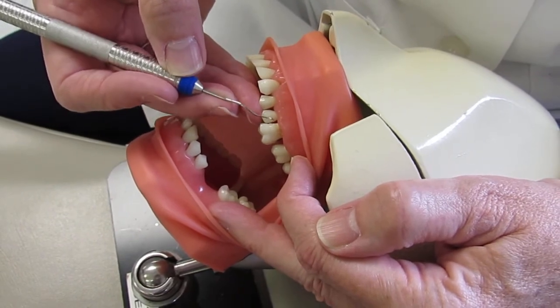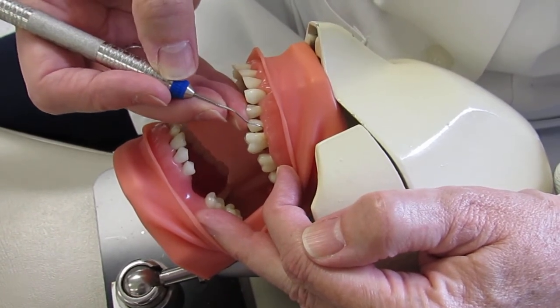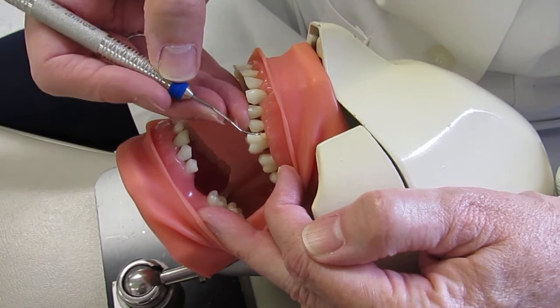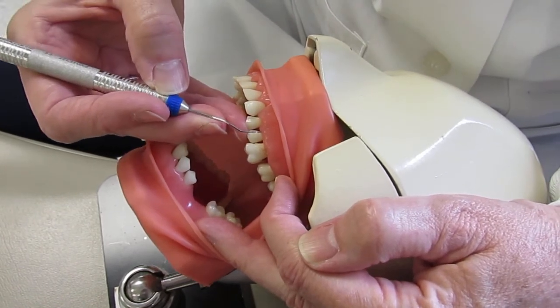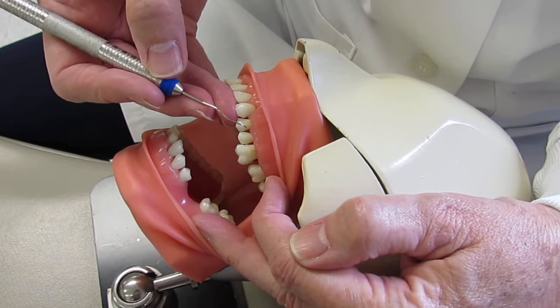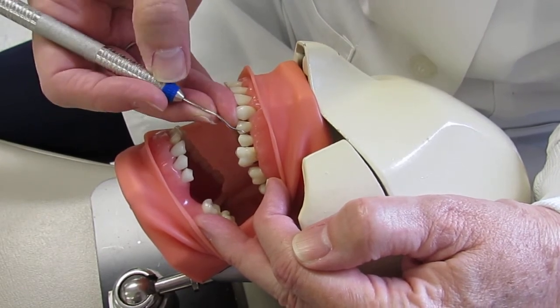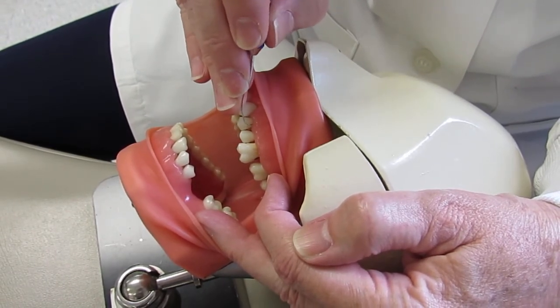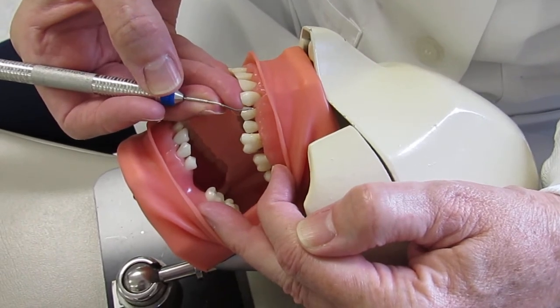Move to the next tooth, taking the opposite lateral side with the get ready zone, inserting, walking, rolling, and getting tall on the fulcrum — again halfway across. Come out, quarter turn, get ready zone, insert. Repeat this tooth to tooth, adjusting your hand as needed. For the premolars, a very horizontal position works well — it's comfortable, with a very short walking length on that narrow tooth.